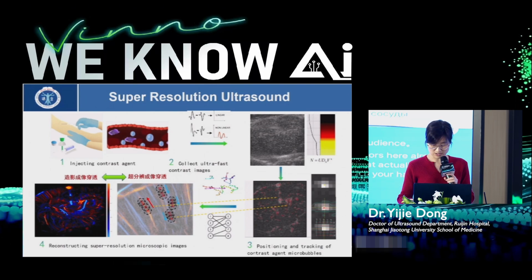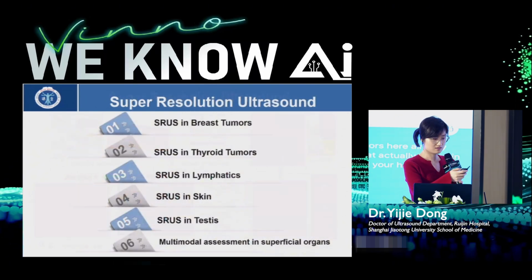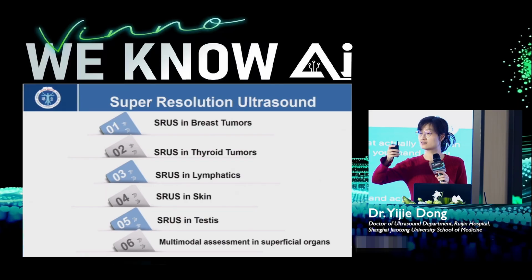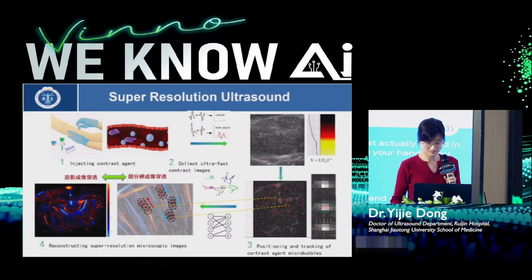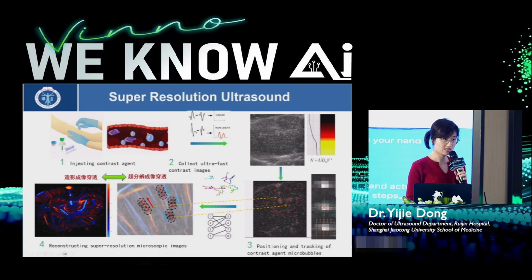Can you see the bubbles here? Microbubbles within the vessels. And it is not only in vascular, but also in lymphatic vessels or the gaps that the contrast agents can enter.